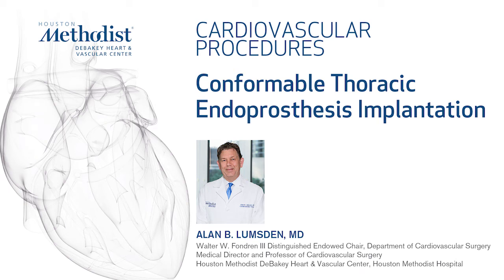This is a presentation of treatment of chronic dissection with aneurysmal degeneration using three conformable thoracic endoprostheses.